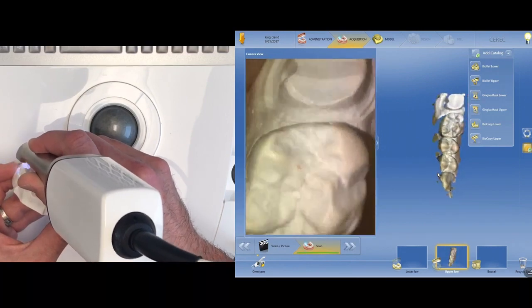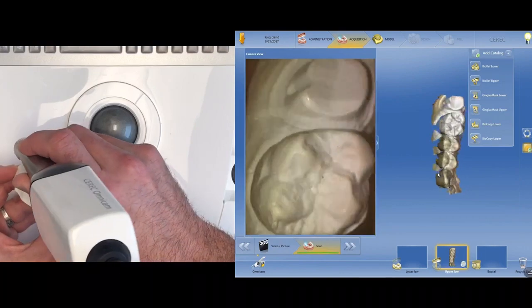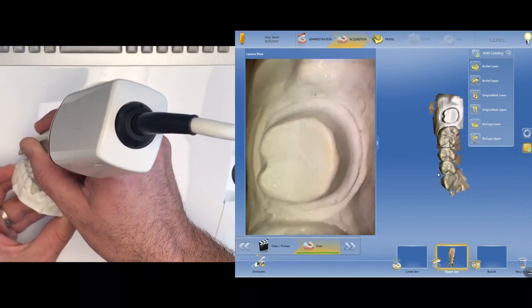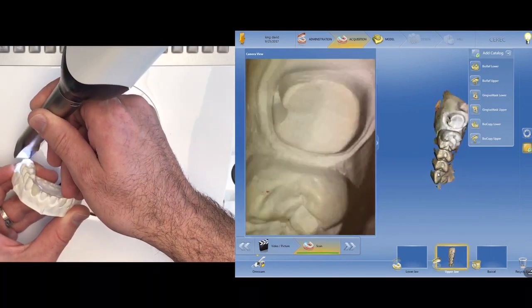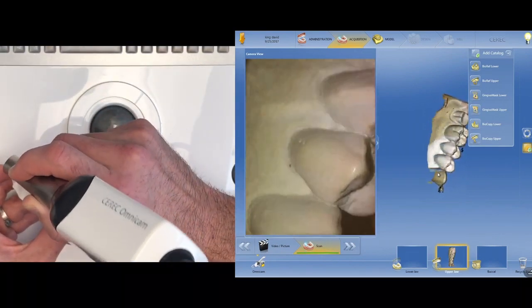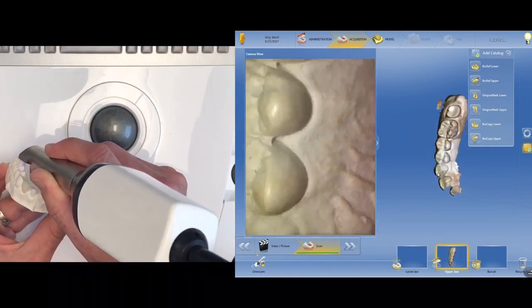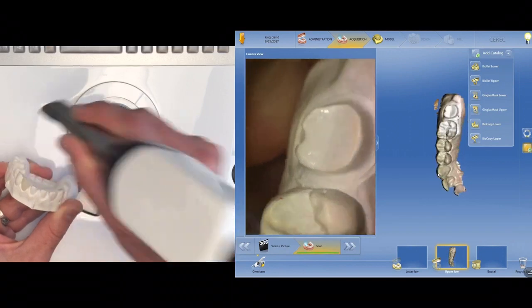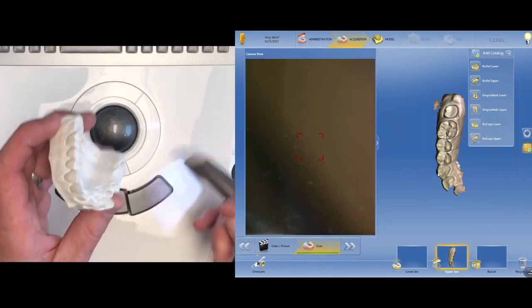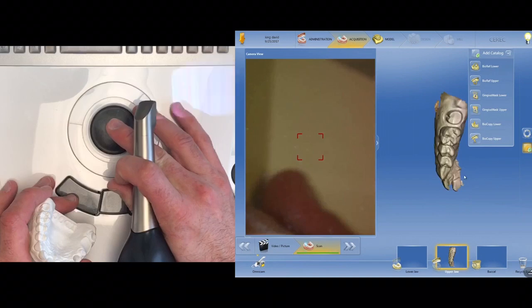As you can see here, usually I do one big swath of the occlusal, and then I'm going to rotate just a little bit, image the prepared tooth, rotate around it, make sure I get that distal surface of the mesial tooth. Then I want to get the buccal side, go back around the palatal side, and that should be it. Then I'll take a look and make sure I got enough data. If we look over here on the CEREC machine, the image looks pretty clear.